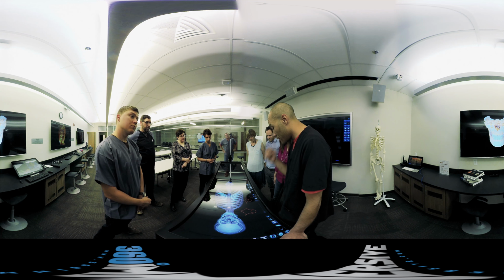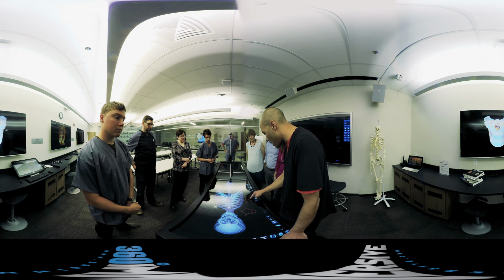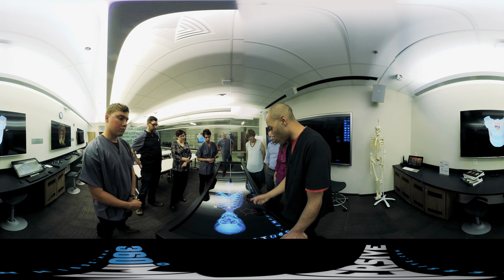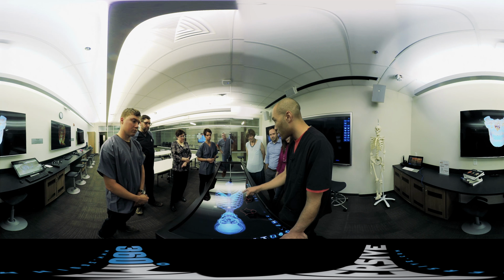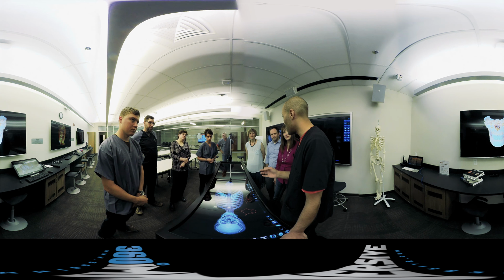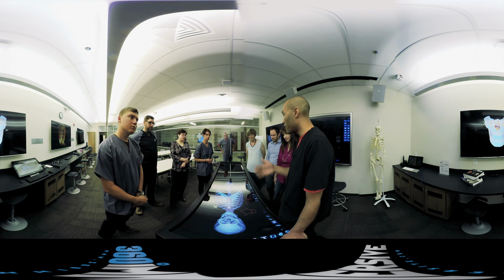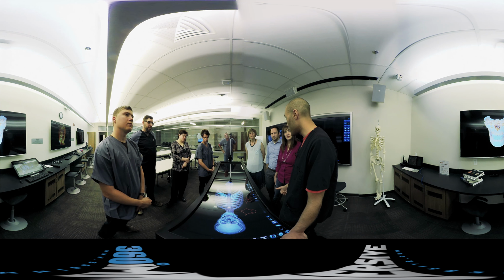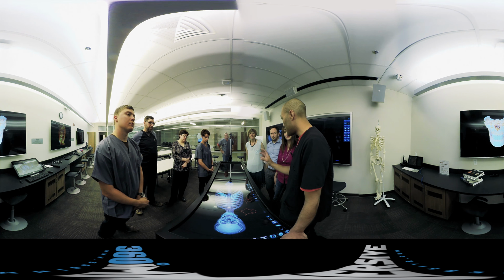In the thoracic region, this costal element actually grows out, and we have the head of the rib in contact with the body, and then that swoops around to make some contact with the transverse process and then comes all the way around. But everywhere else, we just end up without that. So that transverse process isn't a true transverse process all the way down. At least that's not all it is, right? There's that rib element. I mean, think of other vertebrates like a fish that have ribs at every single level, cervical all the way down to lumbar regions. We're all vertebrates, and that is in our phylogeny.